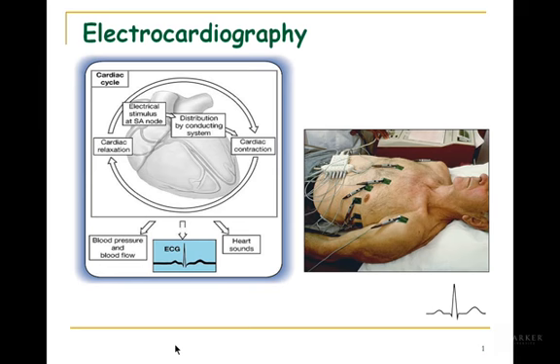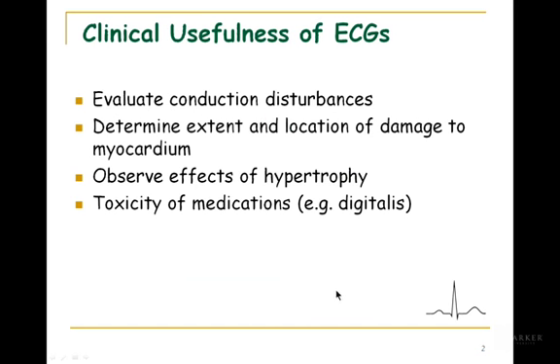What we're able to see is we're going to look at the heart in multiple angles or views, at any given point in time, and you can get a lot of information about the general direction of the activation of the heart during that specific period of time. Now, the ECGs that we do today are far different from what they did in 1902, which is when the first one was done on humans. So we'll show you a picture of what it looks like in a moment.